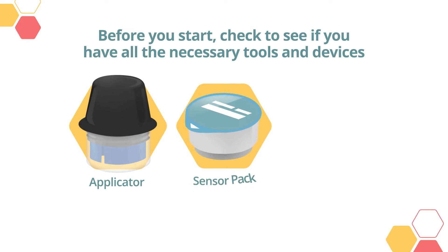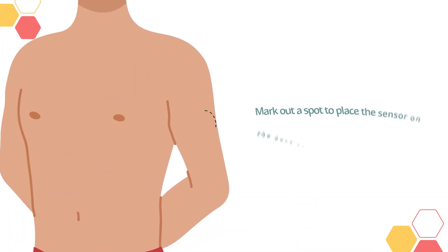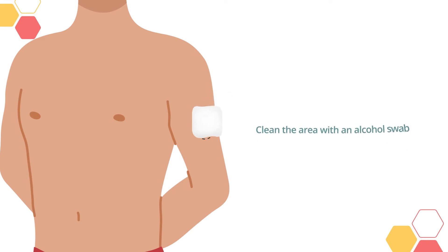You will need an applicator, sensor pack, and alcohol swabs. First, mark out a spot to place the sensor on the back of the upper arm. This spot may also be on the stomach. Then clean the area with an alcohol swab.